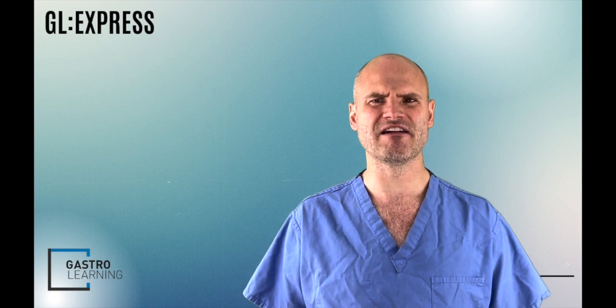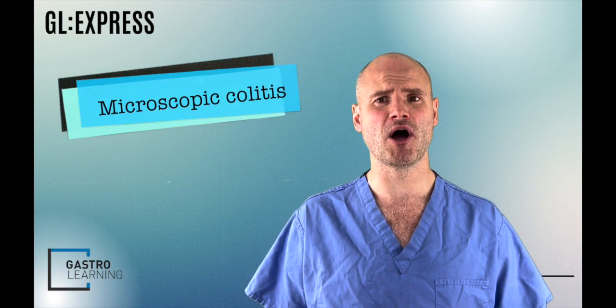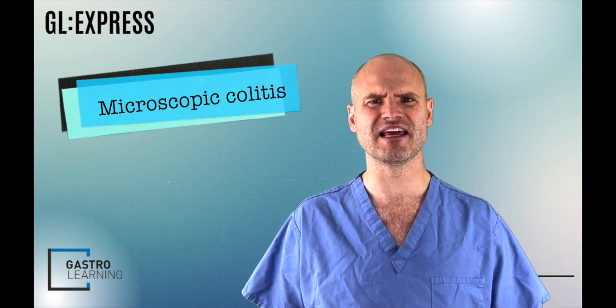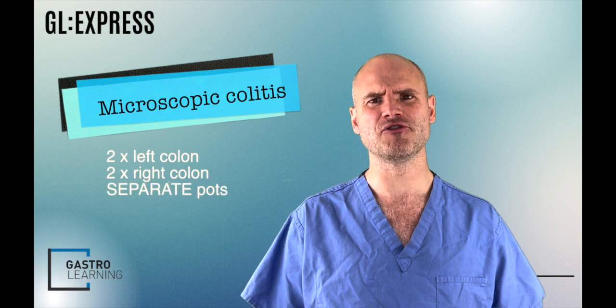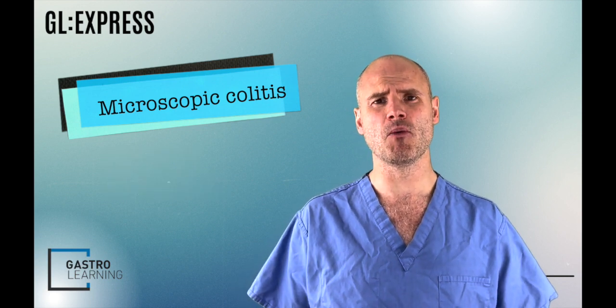In patients where a diagnosis of microscopic colitis is suspected and therefore requires biopsies in entirely normal colons, they suggest that biopsies are taken in the left colon and 2 biopsies are taken in the right colon and placed in different pots labelled accordingly.